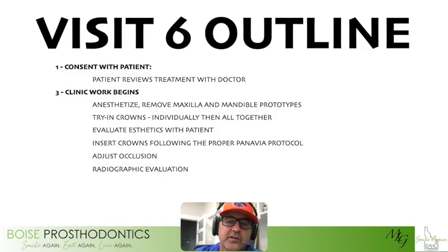I go through and make sure each one fits each tooth perfectly. If I confirm that, then I put them all in together, verifying that the fit between the teeth and the bite is good. Then the patient approves, evaluates them to see if they like them. If they don't, we don't deliver them.